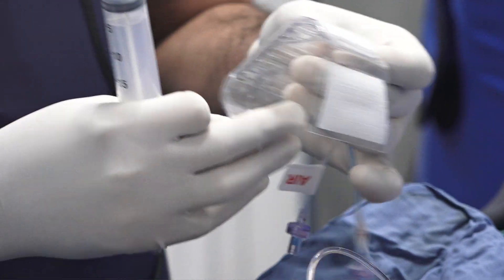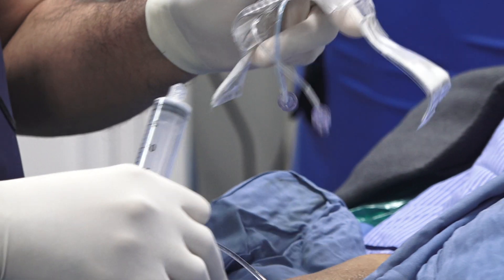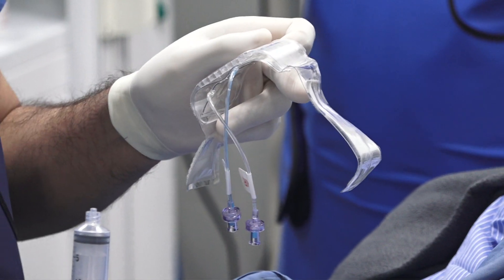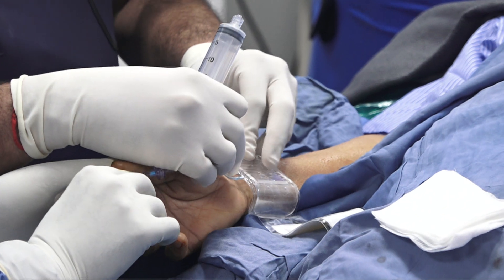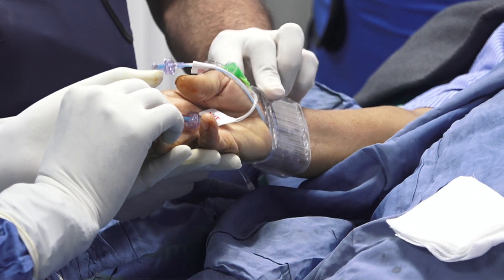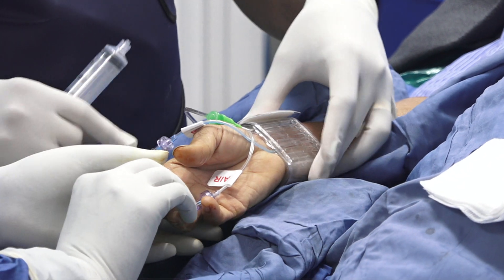Now I'm going to show you how to apply. The tubings go towards the palm. We pull the sheaths back a little. This is a very tiny radial, so very high risk for occlusion. We are going to position the radial balloon on the radial side. The ulnar balloon will automatically take its place, and we apply it in a very snug fashion.